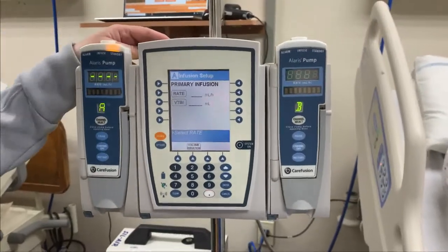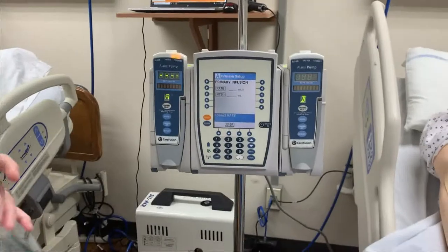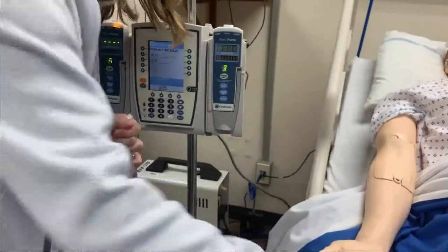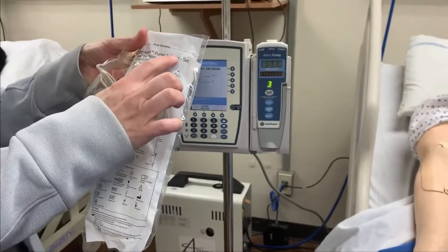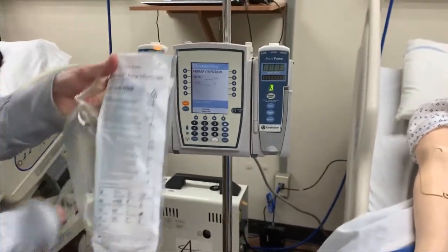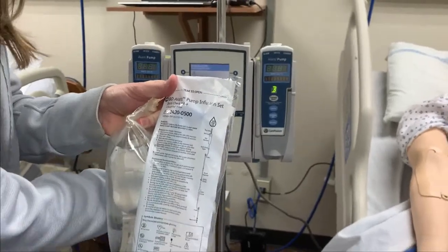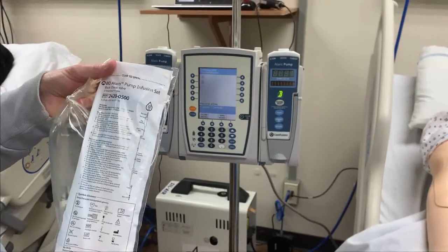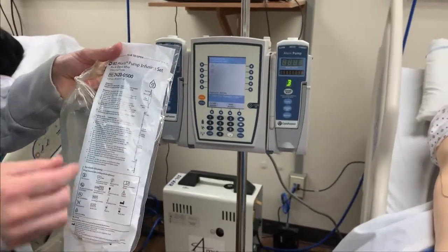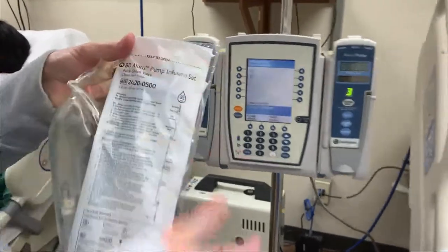I've checked my order and the doctor ordered half normal saline, so I've got to prime my tubing. We use the Alaris tubing — when you're out there, look for the Alaris pump infusion set. Directly next to the tubing you'll find blood tubing. Don't grab that — it has two spikes on it and you don't want that. You just want the one that says pump infusion set.